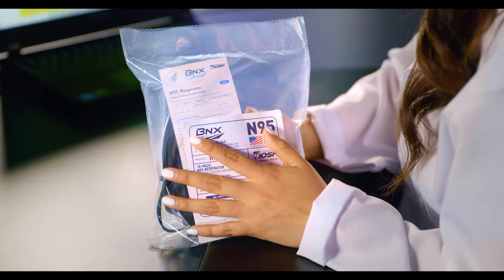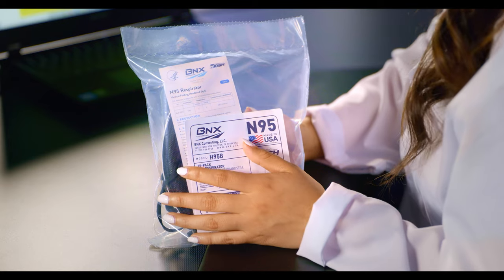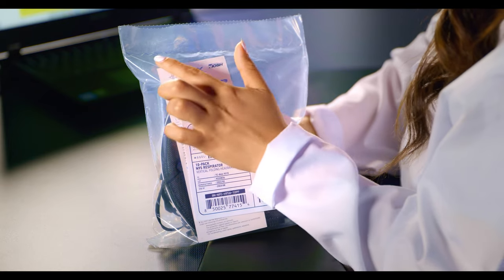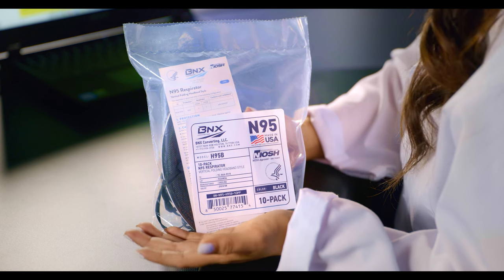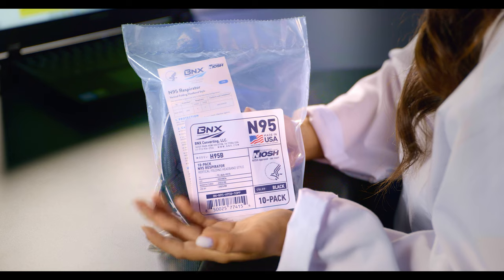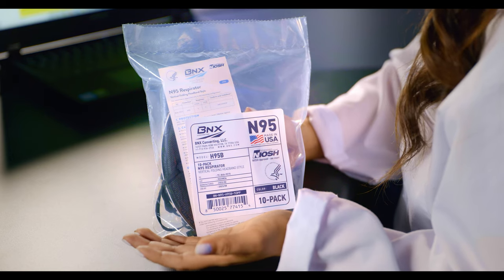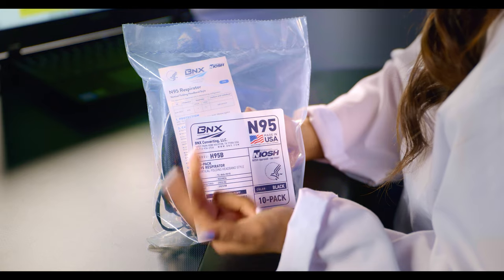These N95 respirators come in both a white and a black style. They come packaged in a heat-sealed plastic bag and although they're not individually wrapped, this packaging helps reduce waste and minimizes the plastic smell that you might get when using individually wrapped respirators. The lot number is located on the packaging along with the manufacture date and use-by date.